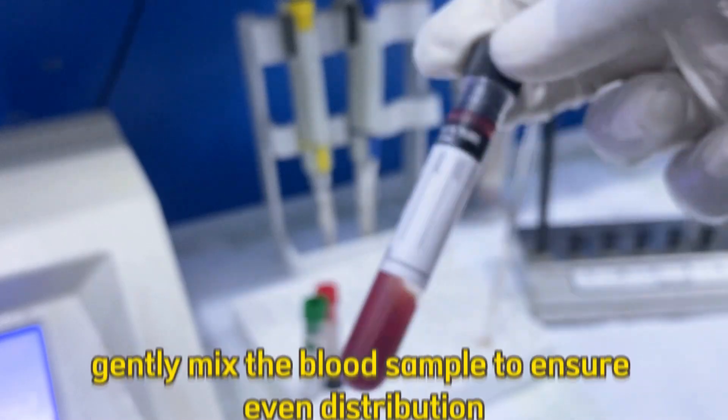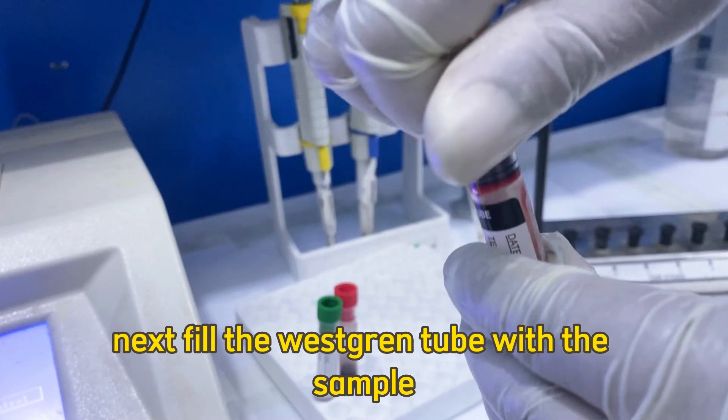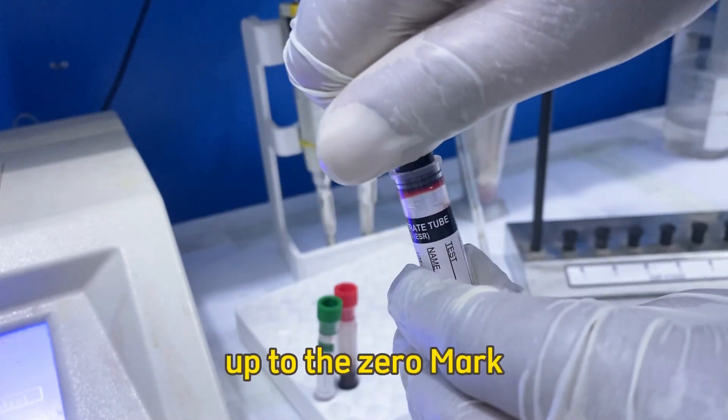First, gently mix the blood sample to ensure even distribution. Next, fill the Westergren tube with the sample up to the zero mark.